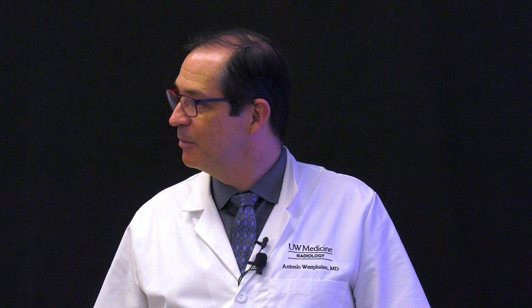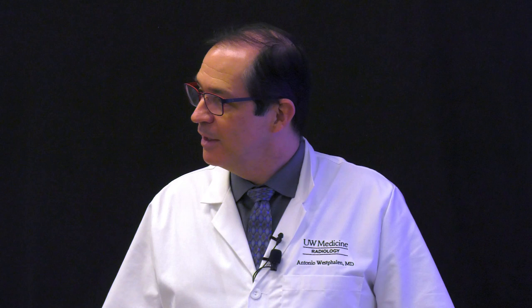You inject it and maybe you wait a little bit longer, and then everything washes out except where the tumor is. I actually went online, and there was a group in China trying to combine gadolinium and PSMA, but I don't think the signal is enough. It's not like there's enough signal to see it. But as we develop new, more powerful, cheaper scanners, maybe there will be signal. And there will be markers like that, I suspect. If it's going to be PSMA, who knows.